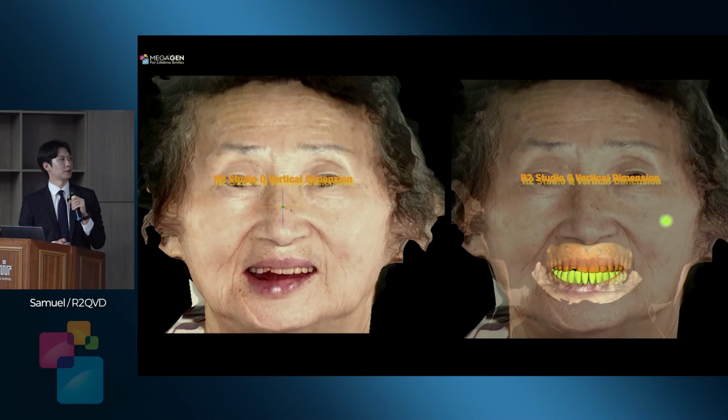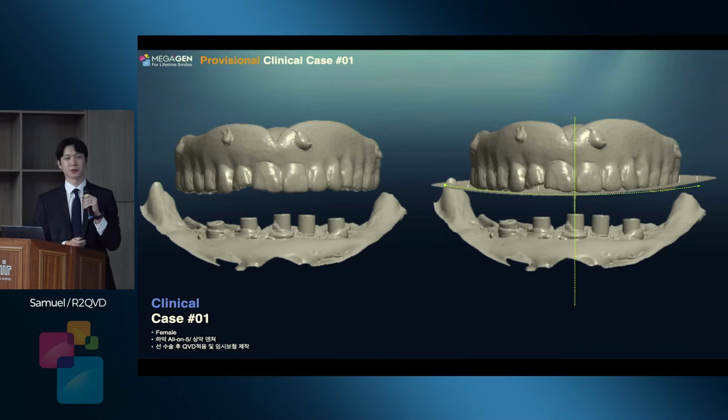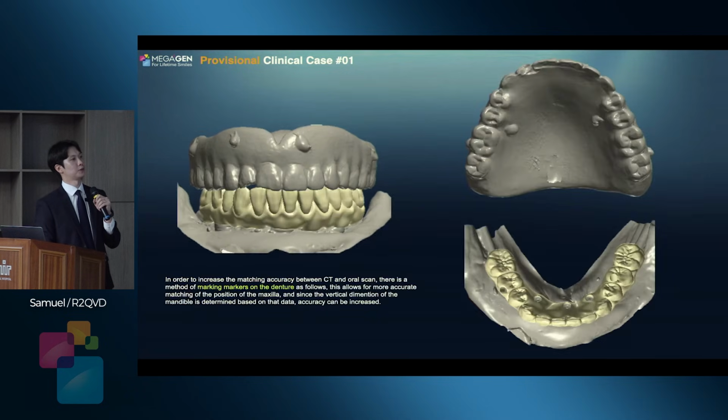It's before. Actually, it's after surgery. Then we evaluate the wax-up and send it to the lab technician. They make a crown with this occlusal plate. It's very simple. Here is the mid-sagittal plane, and the curve of Spee and Wilson here. Just load the library crown and position the crown. That's all. Like this.